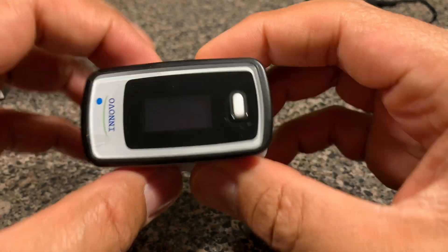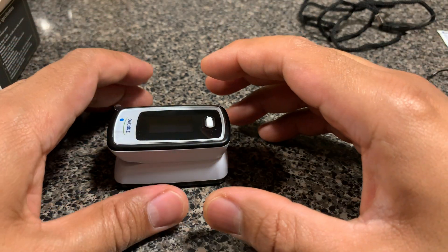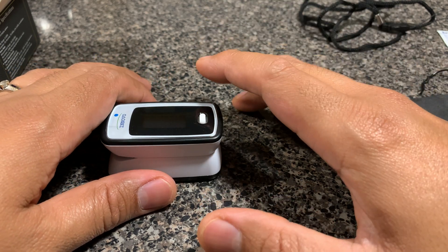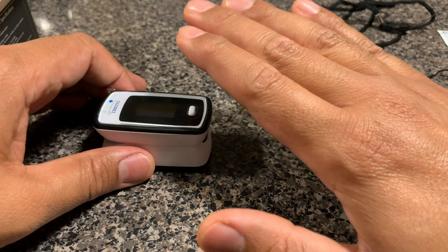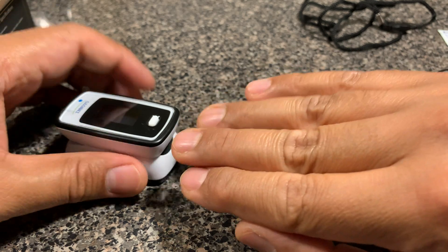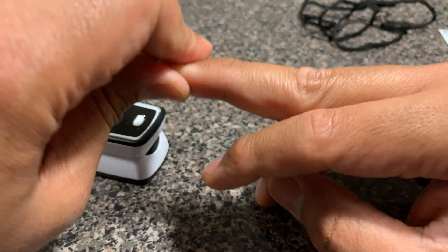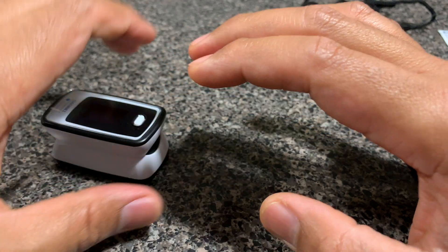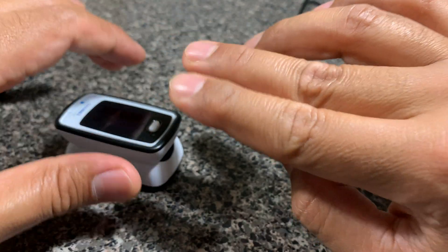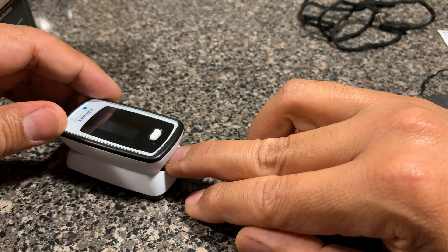Now let me show you how to actually use this product. You can use either your left or right hand, but studies have shown that you should use your dominant hand for the measurement. I'm right-handed, so I'll use my right hand. As for which finger — based on my research, you should use your middle finger, as it's the tallest and strongest finger. You could also use the index finger as they are comparable, but strictly by the book you should use your middle finger.